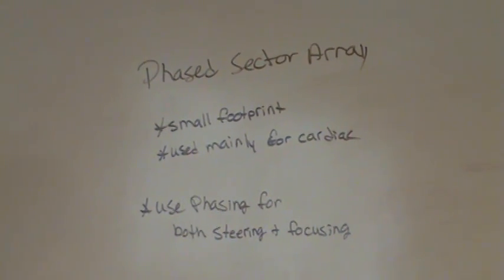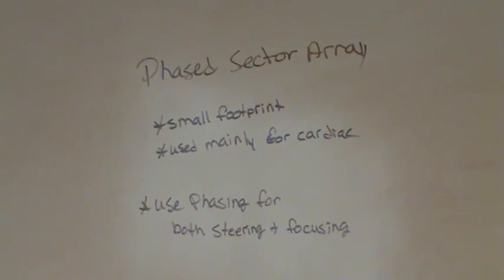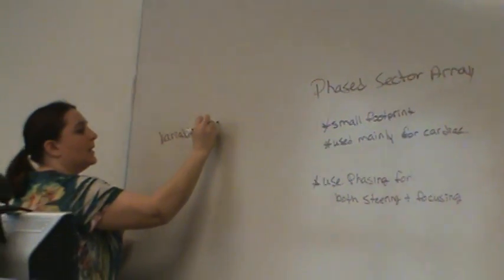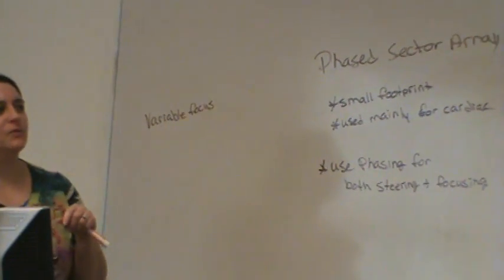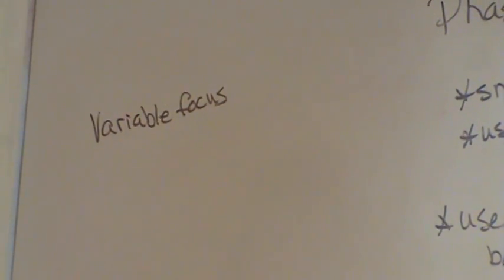By using all this electronic stuff, all of these transducers that we're going to talk about have variable focus. That's something that all of these transducers have. That's the idea behind using phasing. There's a couple other things I'll have to try and remember.